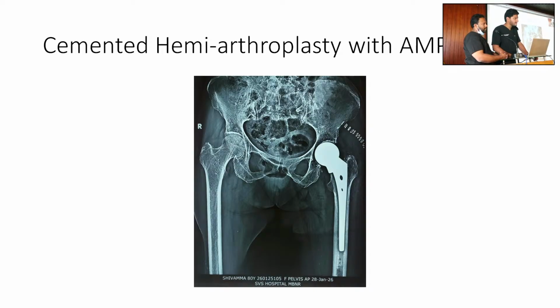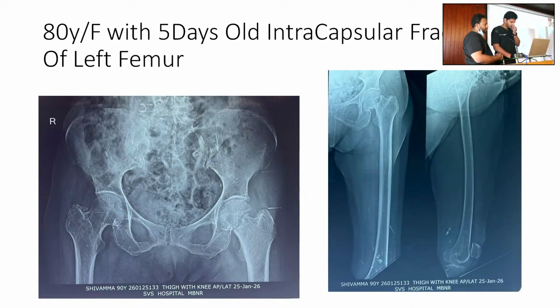Size first. First the X-ray, prior. Now to see this, how much calcar is there? It's quite good. They have cut it a little more. I think it's gone inside. Okay, it may sink down.